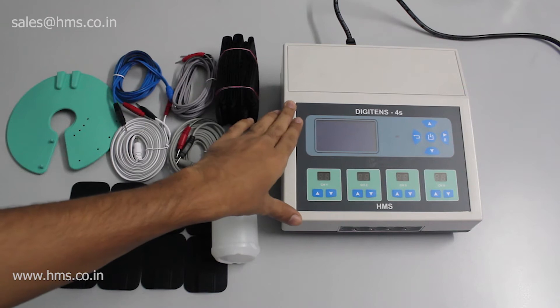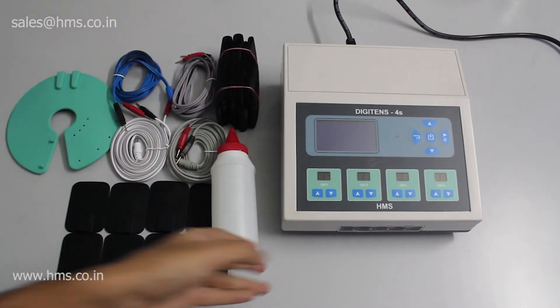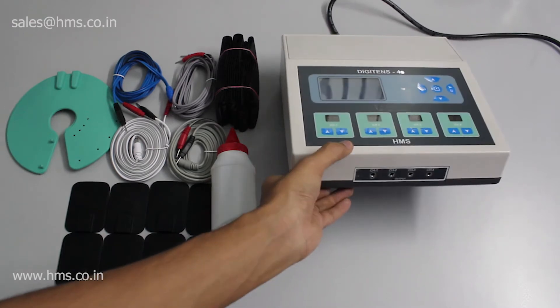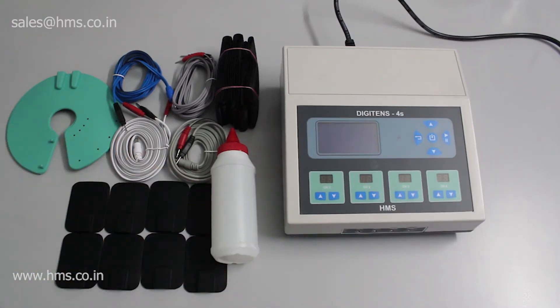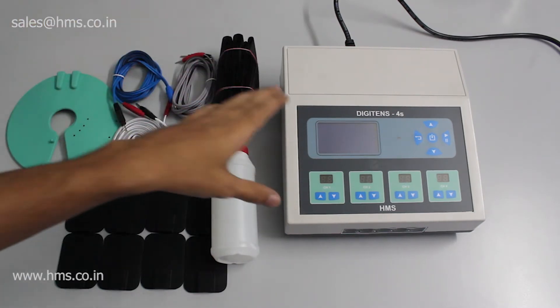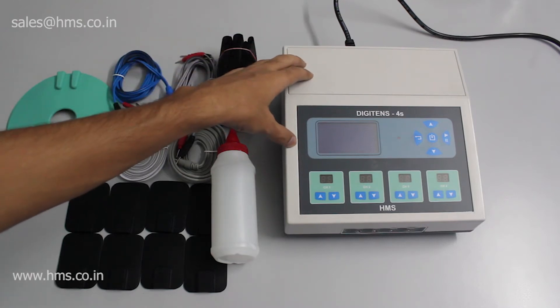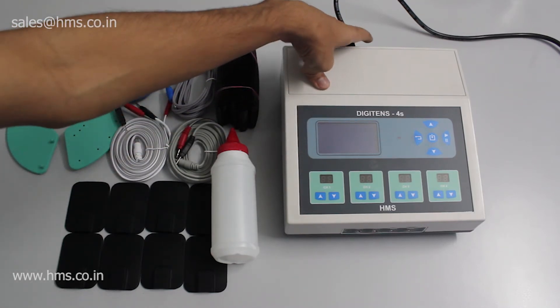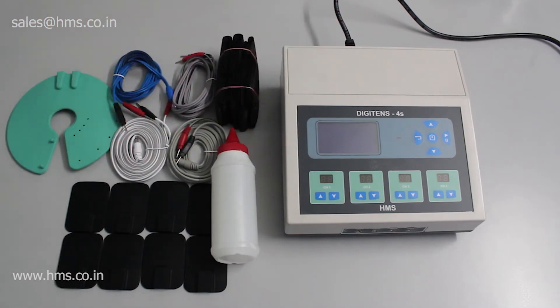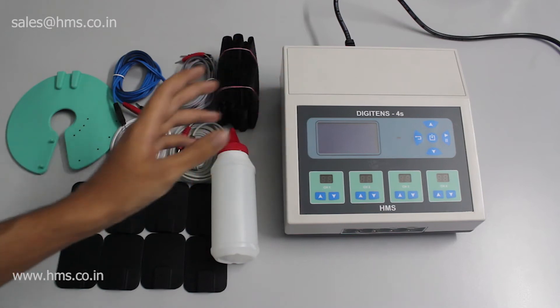This equipment is the DigiTENS 4S — a digital TENS device with four different channels, so you can give treatment at the same time to two different patients using two channels each. That is the main advantage of the DigiTENS 4S. Another big feature is that it's both battery operated and mains operated — you can either plug in the mains cable or use it with a battery.